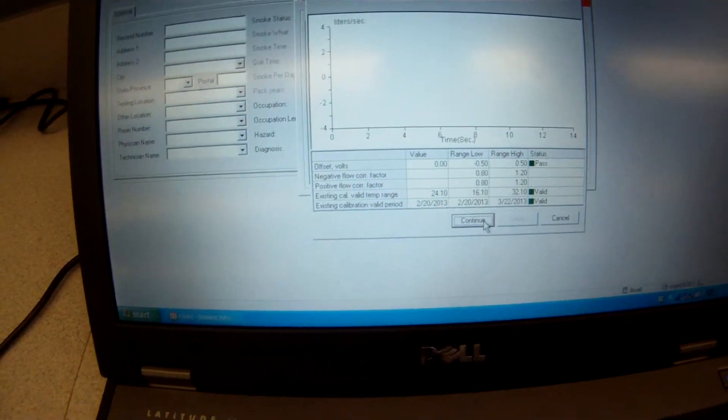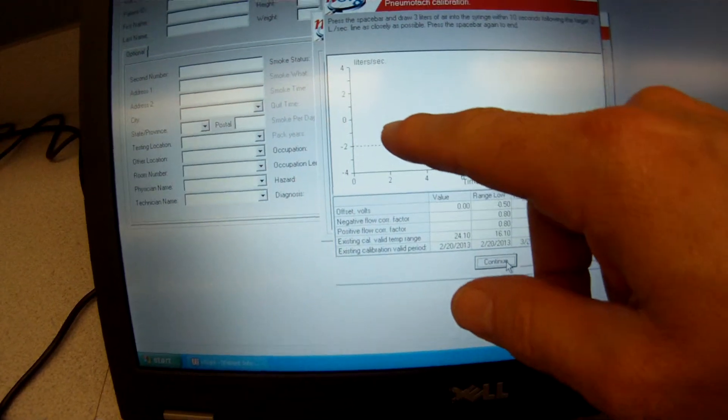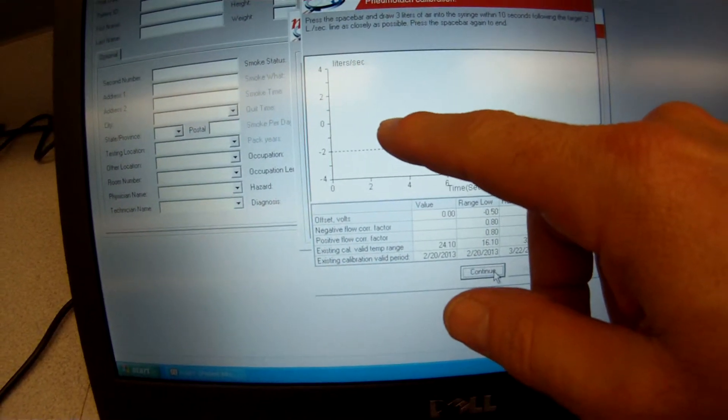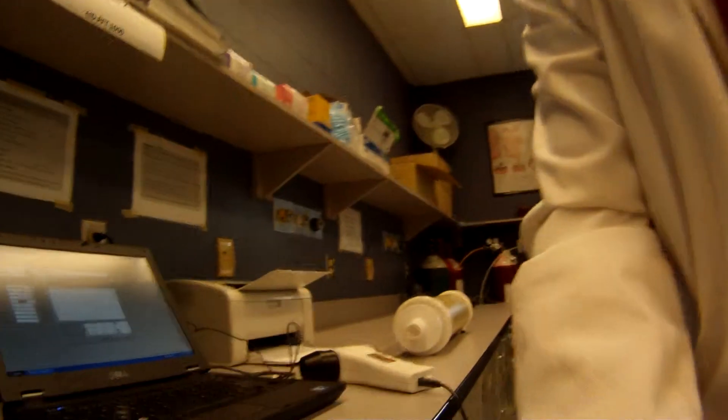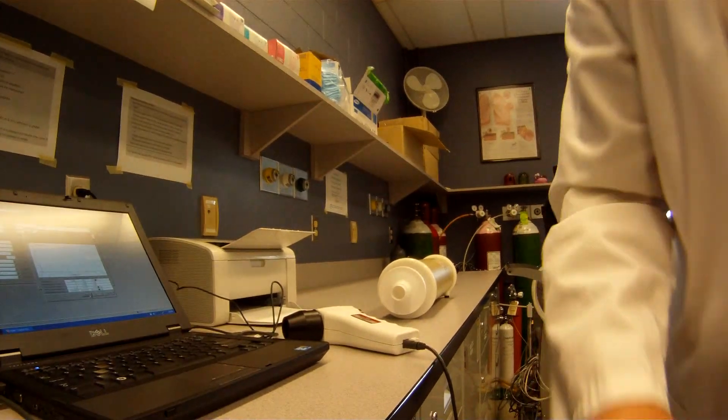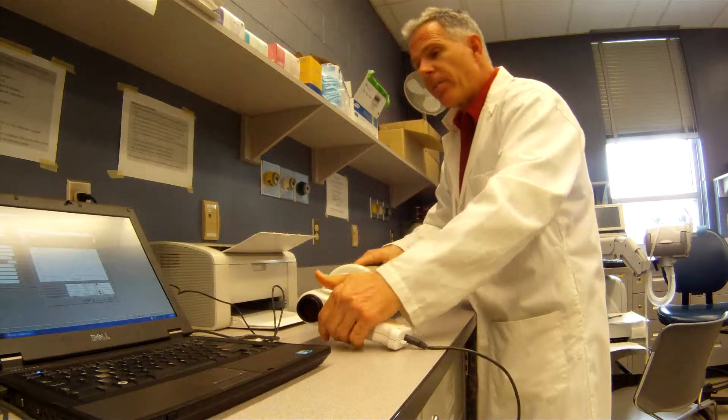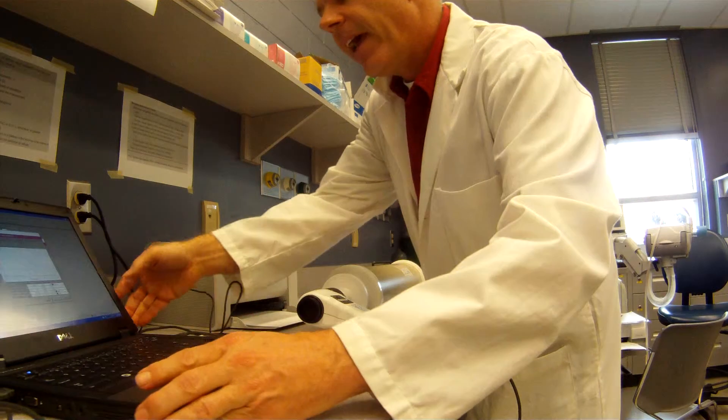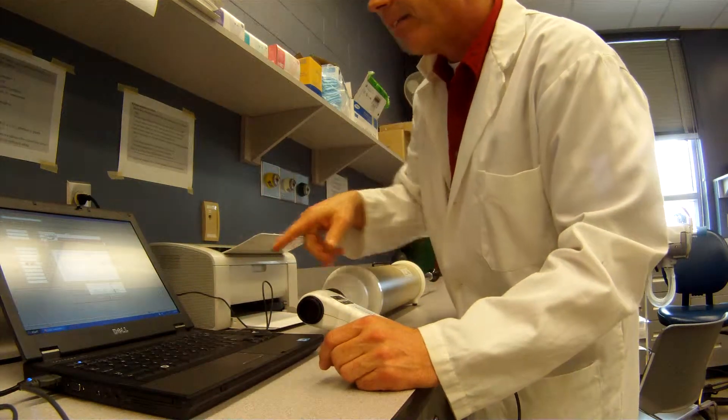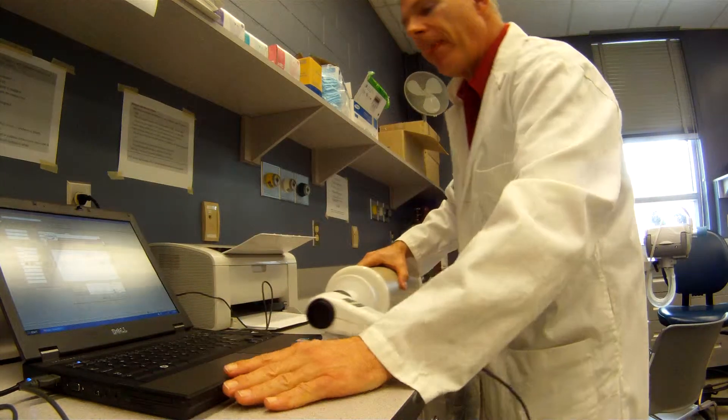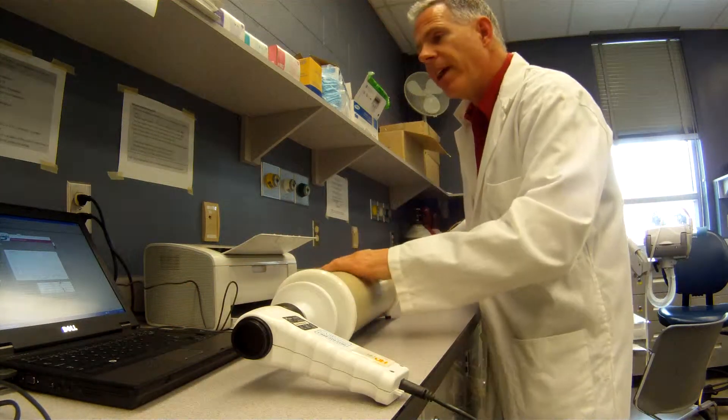It says offset measurement is complete. So now it gives us some targets on where we want to get that flow with our calibration. I'm just going to set this down here. The way this works is I'm going to hook this up to the calibration syringe and I'm going to watch my screen here to make sure that I can get that flow rate through my device. So I go continue.